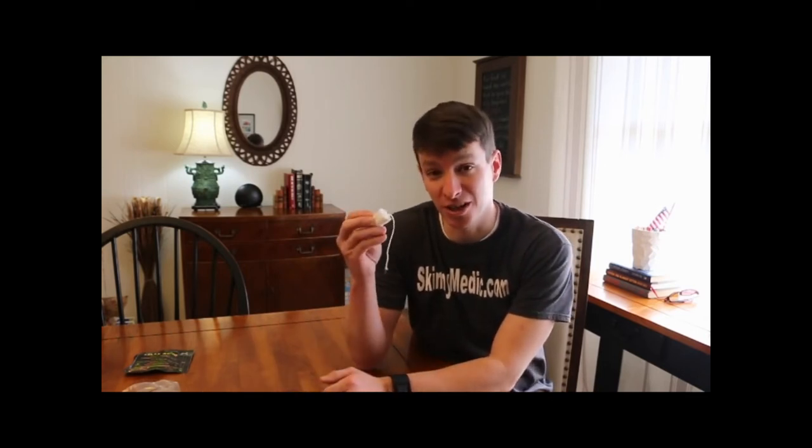We talk about infection, all that stuff. I get it, okay? But at that time, we're just worried about controlling major bleeding. You're talking about you're gonna use this for a gunshot wound. So that's pretty life-threatening. That's pretty scary. So at that point in time, we're just worried about stopping the bleeding. We'll worry about infection later. So I don't see that portion of it.